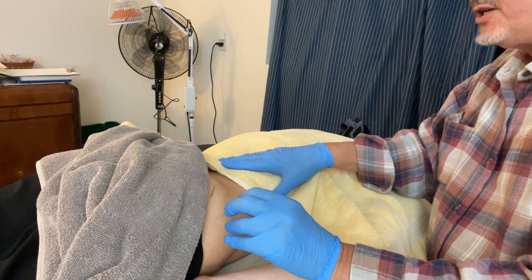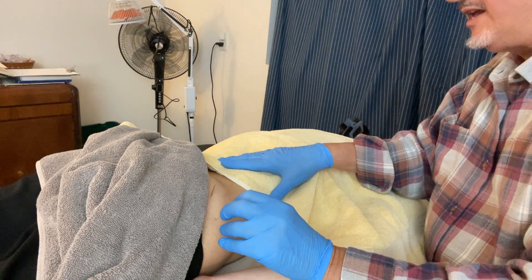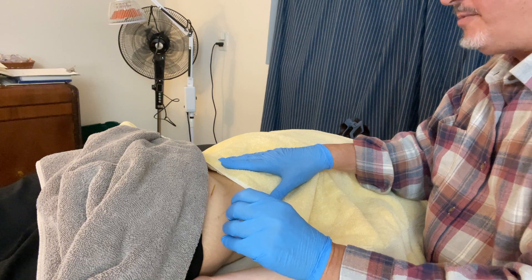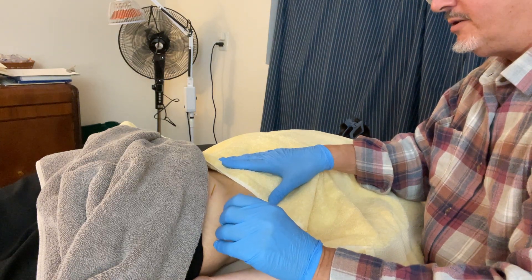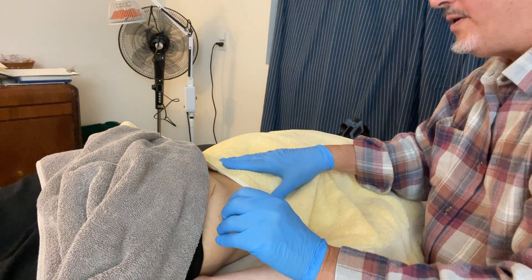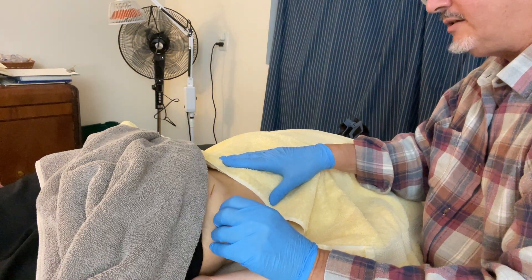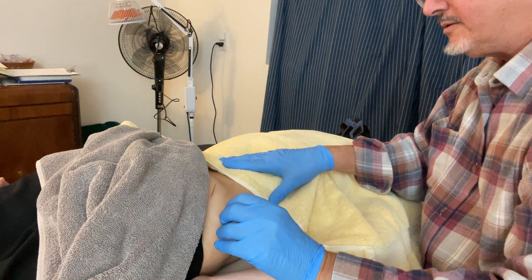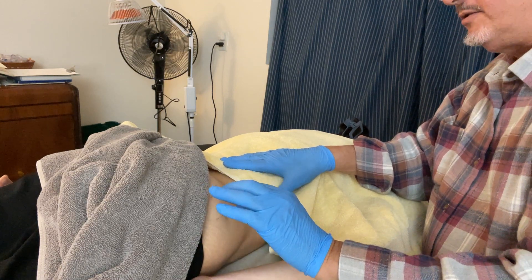Now the tip of the needle is just below the skin, now I'm moving through the fat layer — we all have fat, that's fine — and now I'm in the muscle. The deeper I go, the muscle's tighter. It's really dense. I needle myself as well as get needling done, so I know what that feels like. It's just because it's so deep that it's difficult to pull out and stretch on your own.